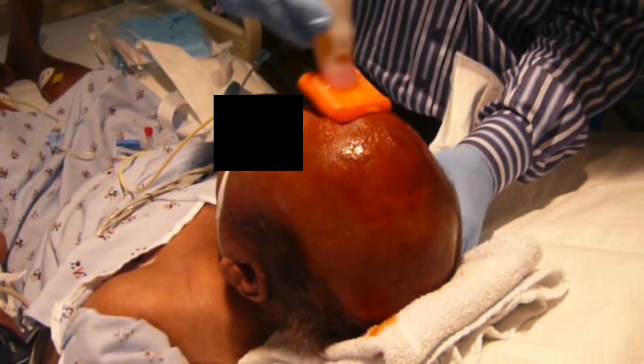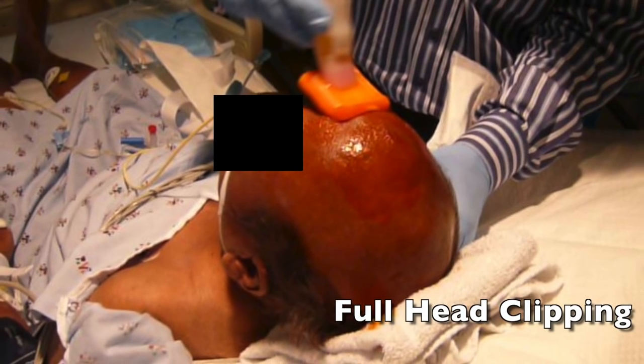This video demonstrates the infection control protocol for EVD placement. First, the entire top of the patient's head is clipped and prepped with chlorhexidine.